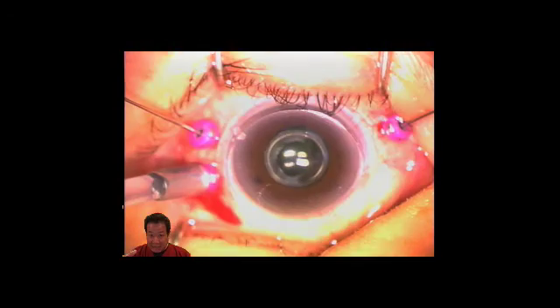That round piece of plastic I just put on top of the eye is an operating contact lens. This allows me, in conjunction with the operating microscope, to magnify and focus on the retinal surface. So what you're going to see me do now is get everything oriented so that the operating microscope and the operating contact lens are working together so that I can easily see the surface of the retina because I'm going to get ready to remove the epiretinal membrane.